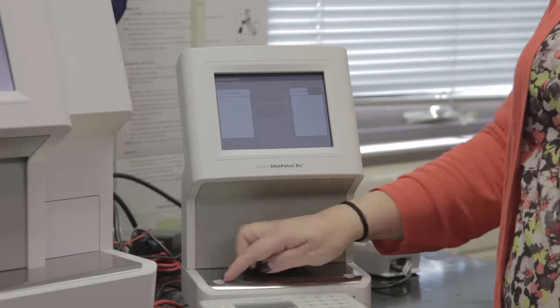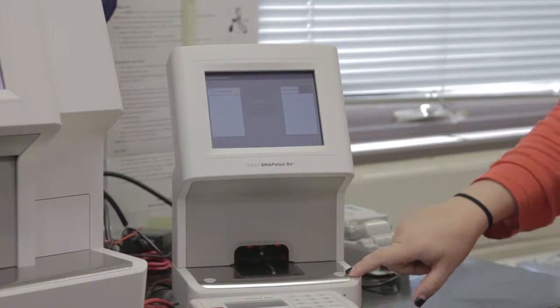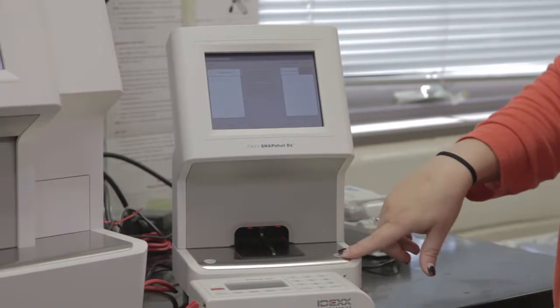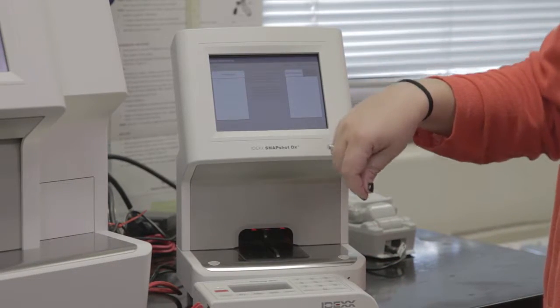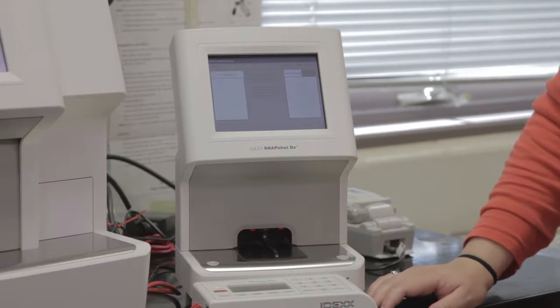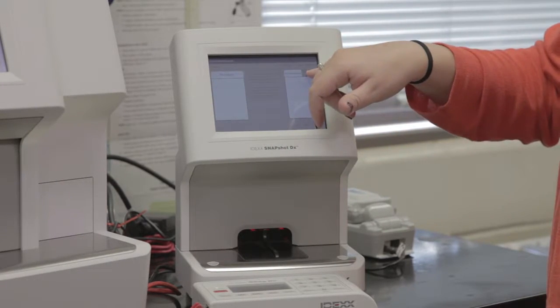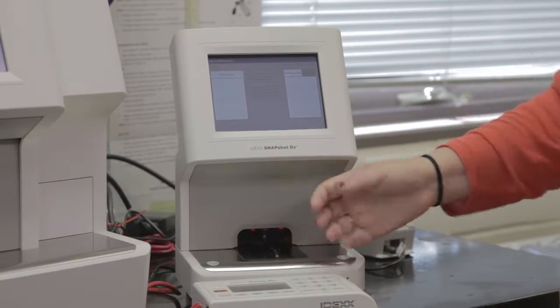These two holes at the front, if you are running bile acids and cortisol, these are your incubator wells. If you had either of those to run, it would talk you through putting your sample in here and letting it incubate for a period of time, and then going ahead and putting that sample then into your SNAP test. When you insert your SNAP in here, it does not eject it at the end of time. So you'll notice that your patient would be not in process anymore, and your results would be under the results tab, and you can just push on your SNAP test and it'll eject it back out.